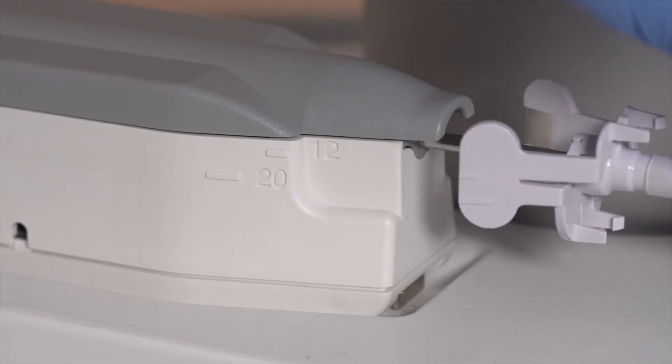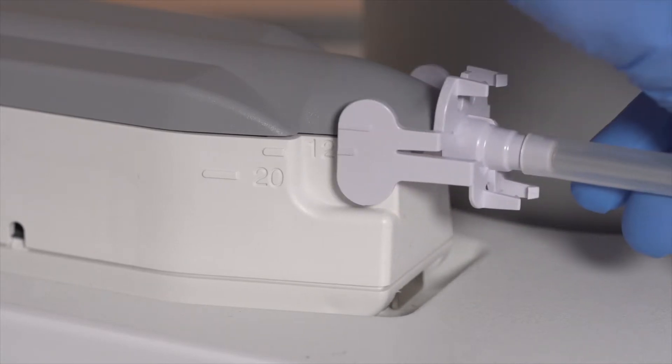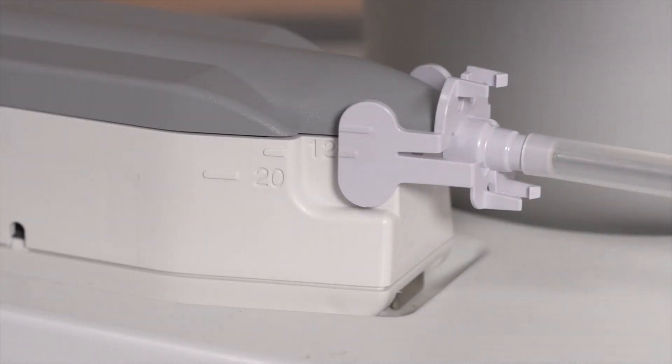Or, rotate the introducer 180 degrees for an aperture of 12mm, where the 12mm mark on the introducer lines up with the short mark on the reusable device driver.